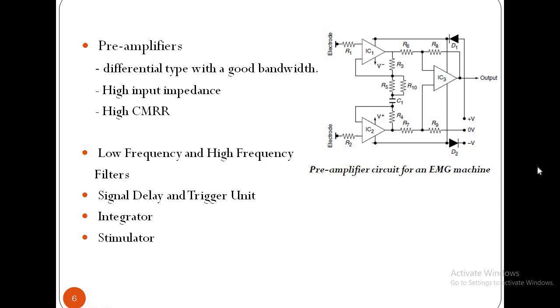Integrator is used for quantifying the activity of a muscle. The integrator operates by rectifying an incoming EMG signal, that is by converting all the negative potentials to identical positive deflections so that the EMG pattern consists of positive deflections only. The area under rectified potentials is accumulated using a low-pass filter so that the module output at any time represents the total area summed from a selected starting time. The integrator indicates the EMG activity either as a variable frequency sawtooth waveform or as a steady deflection.